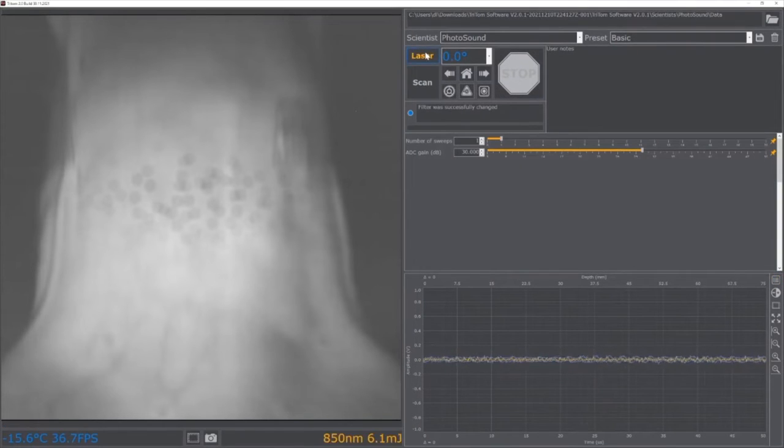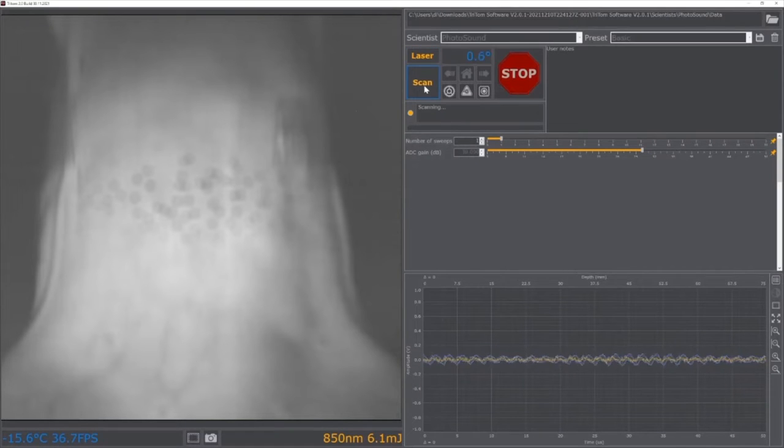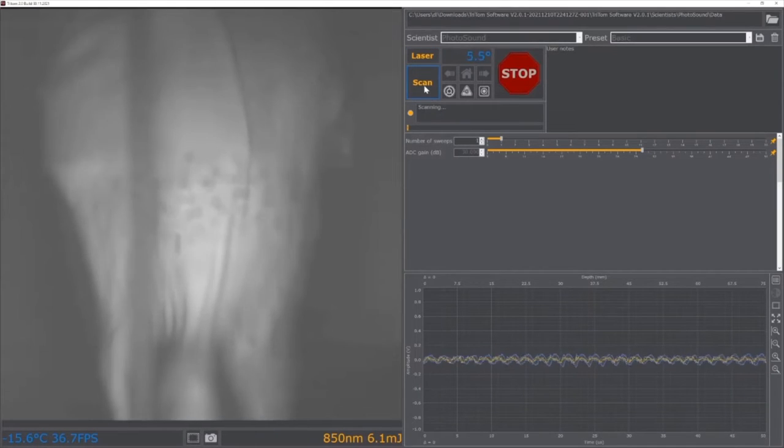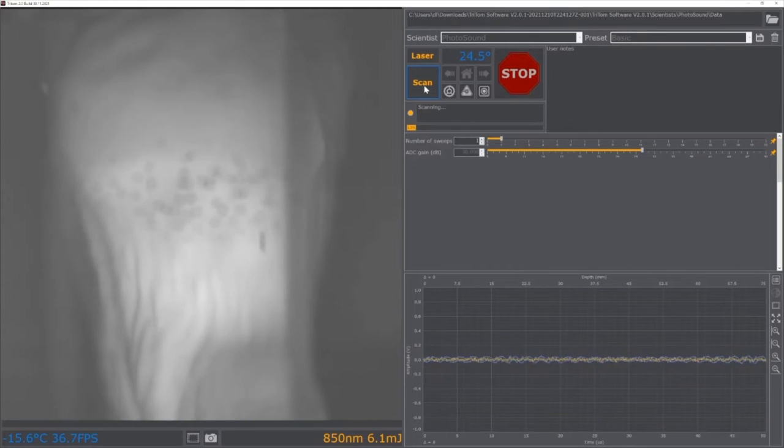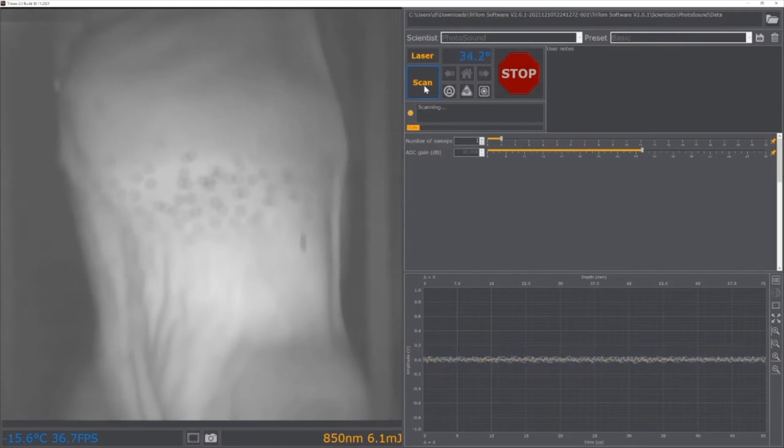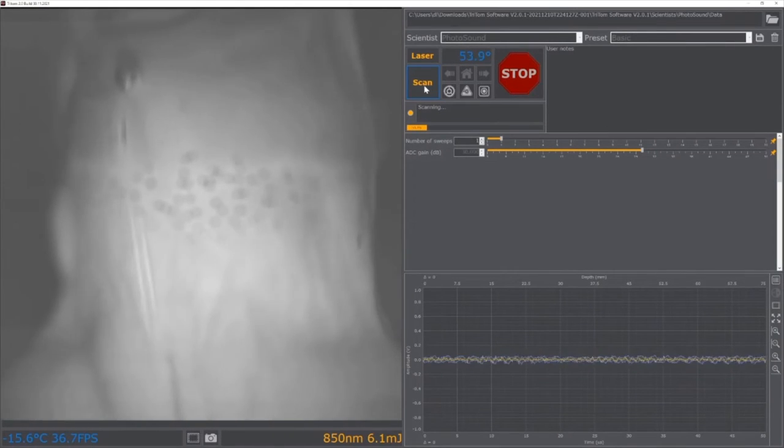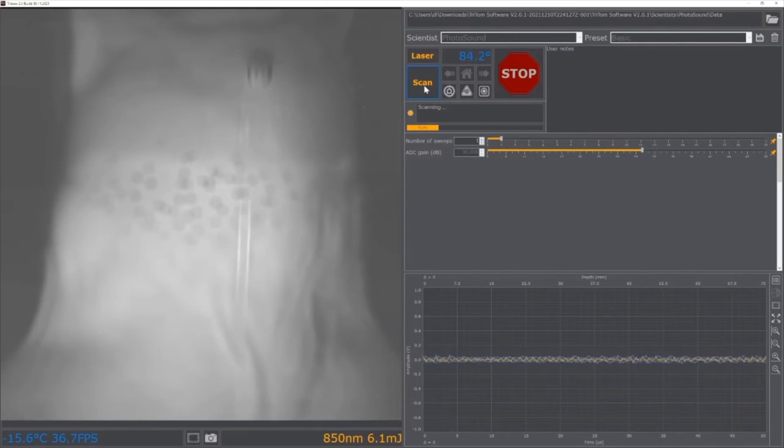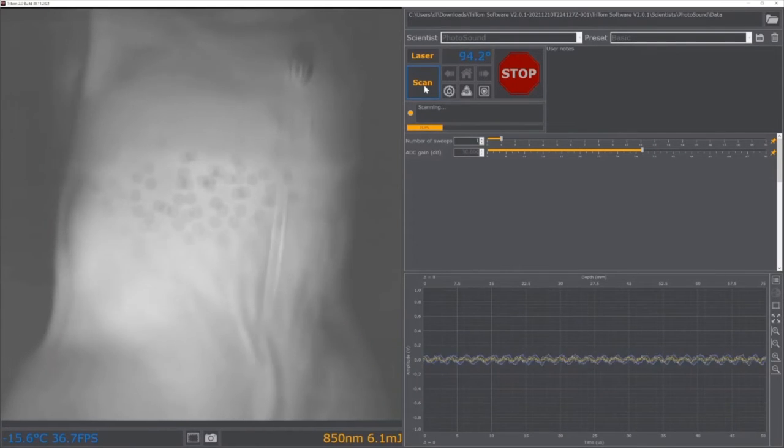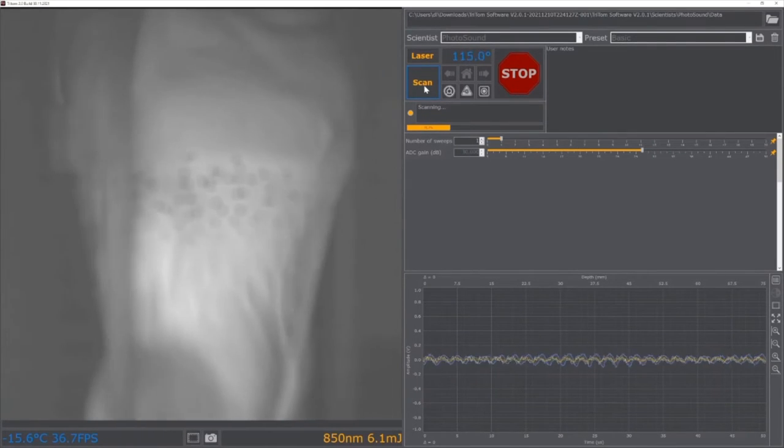After the appropriate scan settings have been applied, press the laser button in the scan settings menu followed by the scan button to initiate a scan. If necessary, the stop button can be pressed at any time during acquisition. This will immediately stop the scan and save all data acquired up to the stopping point.